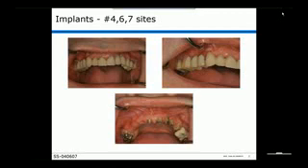And again, scatter is a big deal when it comes to merging files if you're doing optical scanning. And by doing these methods, scatter is absolutely irrelevant to our merges, and we have phenomenal confidence in our merges. Again, there are pictures of the alginate tray and of the scan appliance on our website.